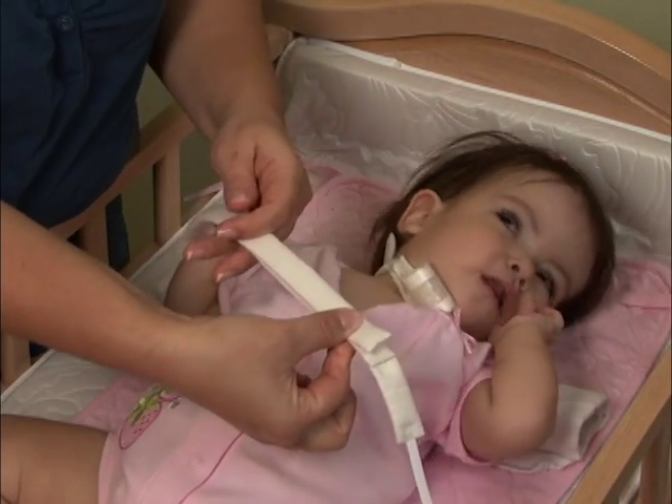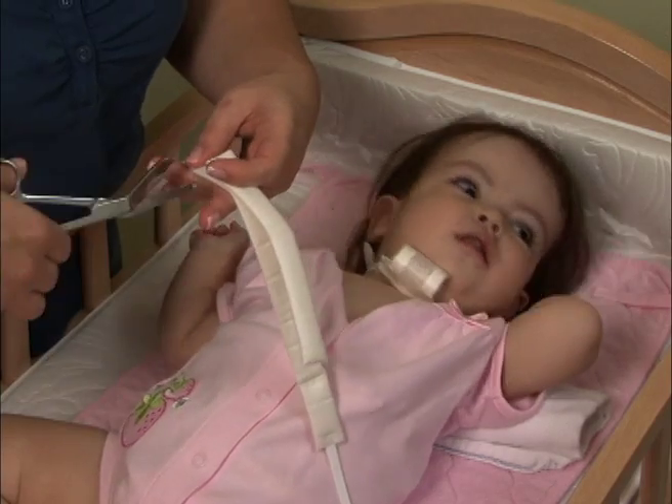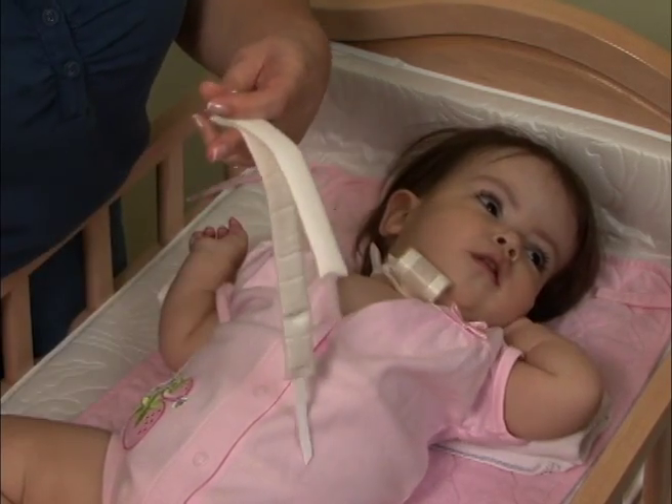Once you get the right size, it is helpful to keep the piece you cut off so you can use it as a template when cutting your trach tie accurately every day.